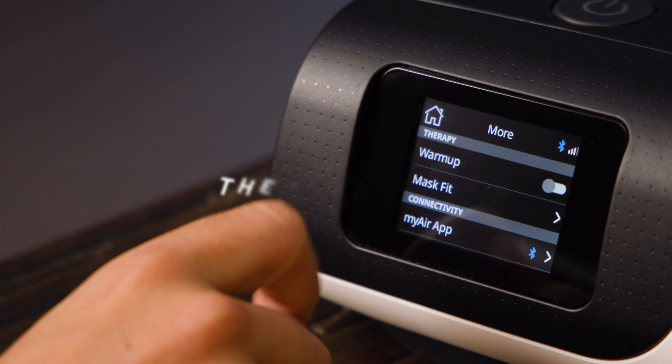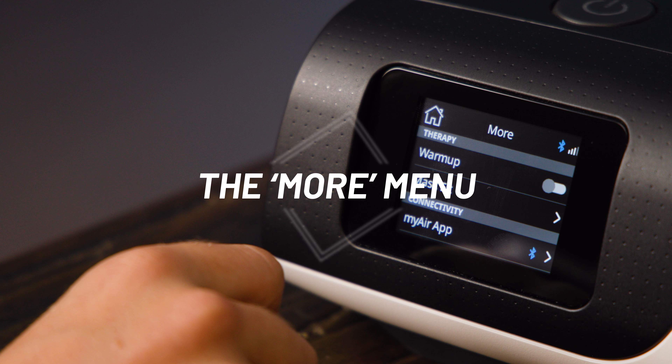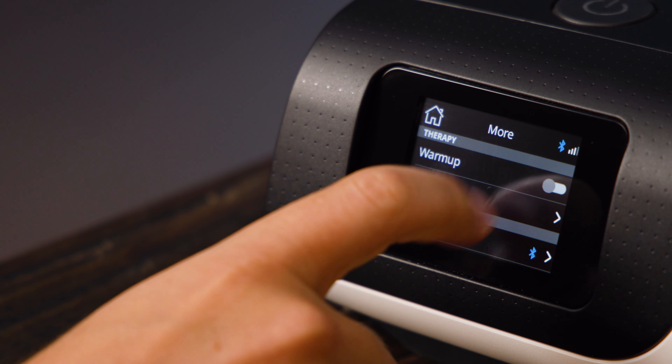The More menu is where some extra features can be accessed. The top option here is Warm-Up. If you activate this, your CPAP will warm the water in your humidifier ready for when you start therapy. We suggest you activate this about 30 minutes before you intend to sleep, so the humidifier is ready to go as soon as you hit start. Without this, the humidifier can take a while to get going.